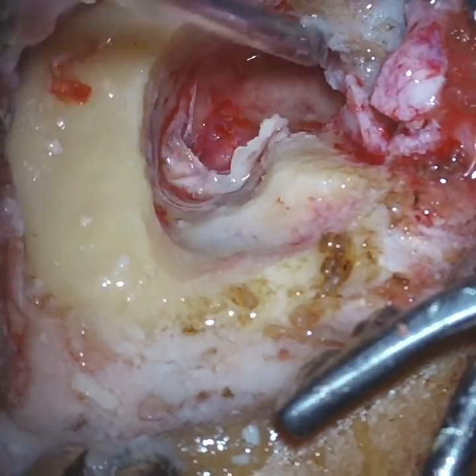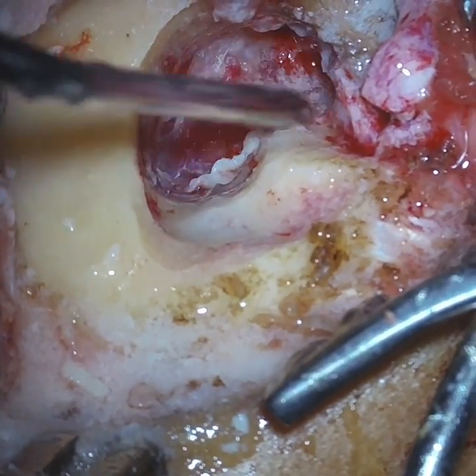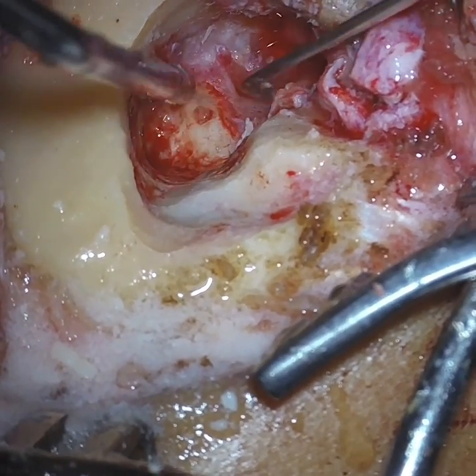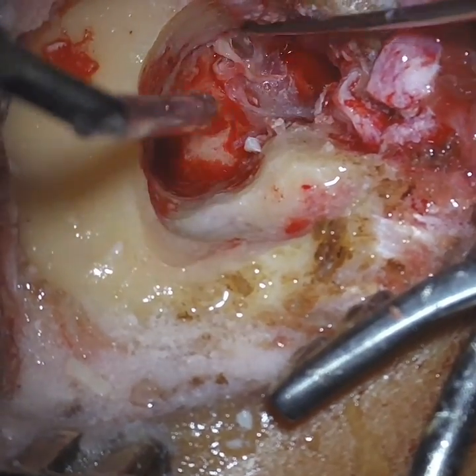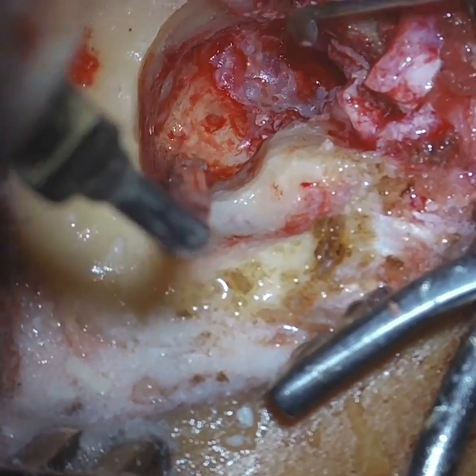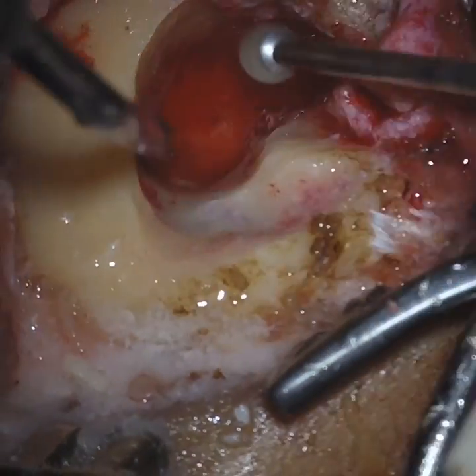This fistula is at the dome of the lateral semicircular canal, and it is the most common area where you will have iatrogenic fistulas also, and then also fistulas by cholesteatoma or any infection or granulation. Once we know we have exposed the fistula, try not to expose too much or go deeper into the fistula, but for the moment just leave the fistula alone and try to do the full mastoid surgery first.